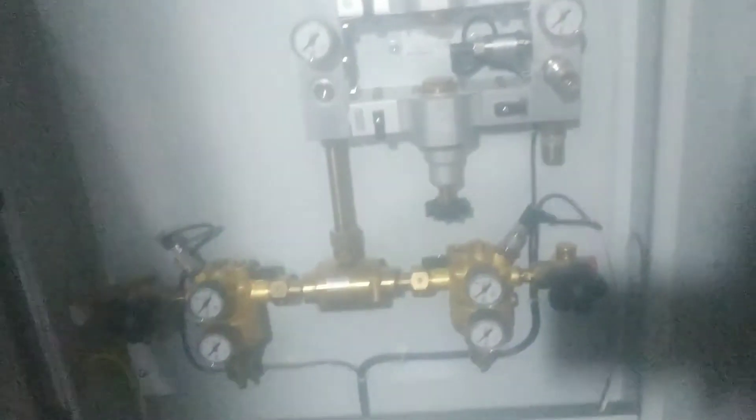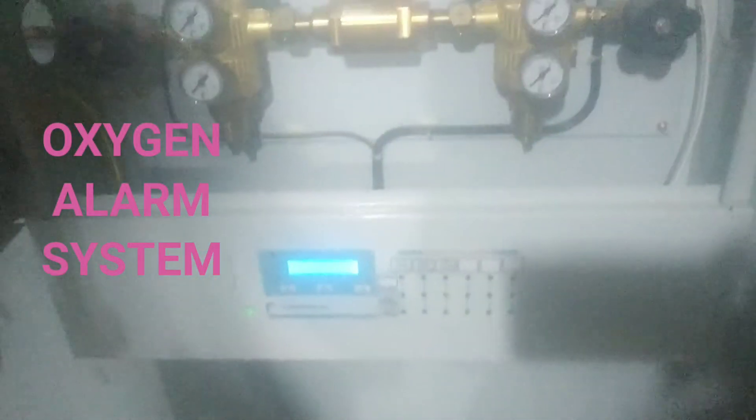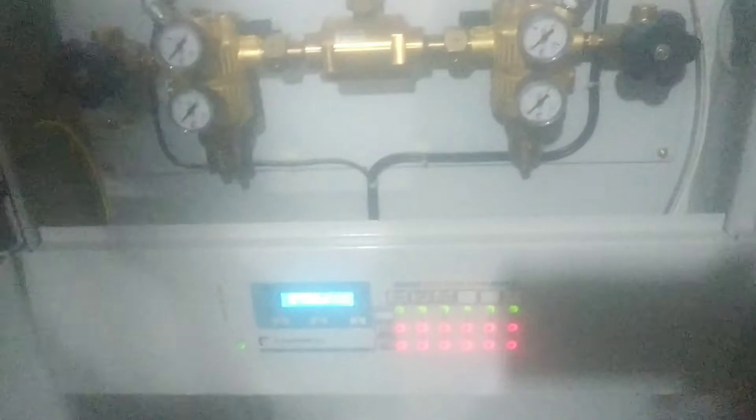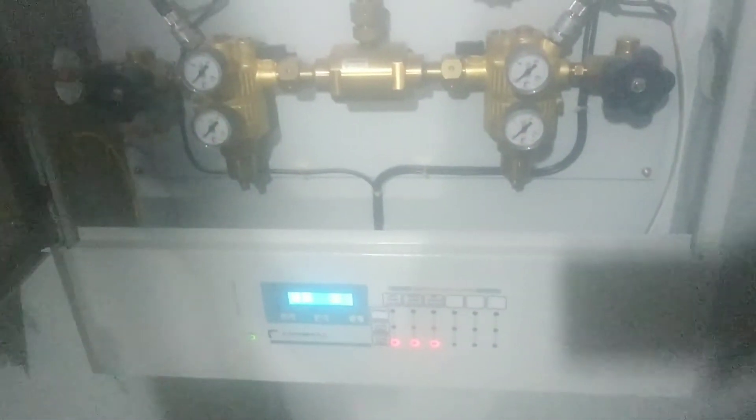This right here is the second manifold. Each manifold has an oxygen alarm system below it. This oxygen alarm system detects low pressure, no pressure, or no oxygen at all — that's what these are useful for.